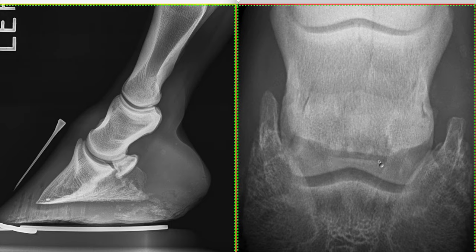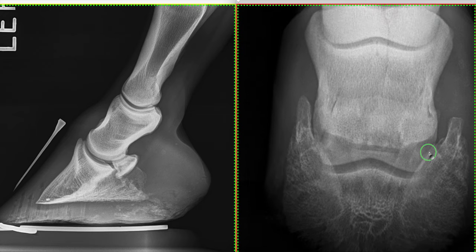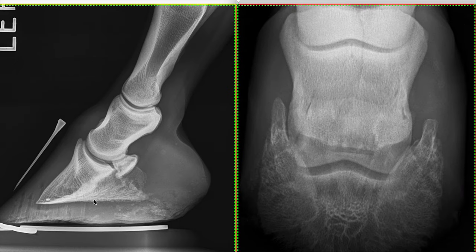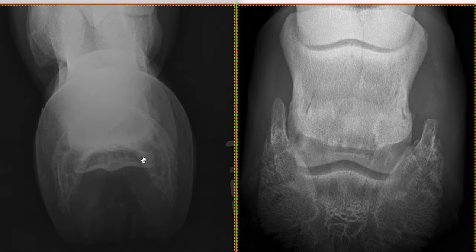So I'm concerned that this navicular bone looks abnormal. The other thing that's concerning me is that our proximal border here is undulating — I would normally expect that to be nice and straight. We've also got a little bit of lateral extension in this corner as well. So this navicular bone is concerning me. I'm going to look at our other view which is good for the navicular bone, which is our palmaroproximal palmarodistal oblique view.